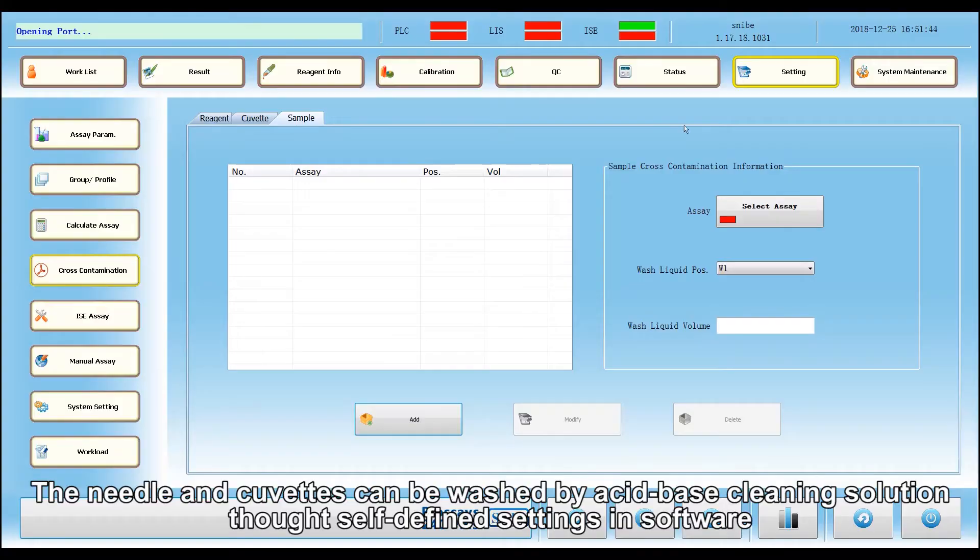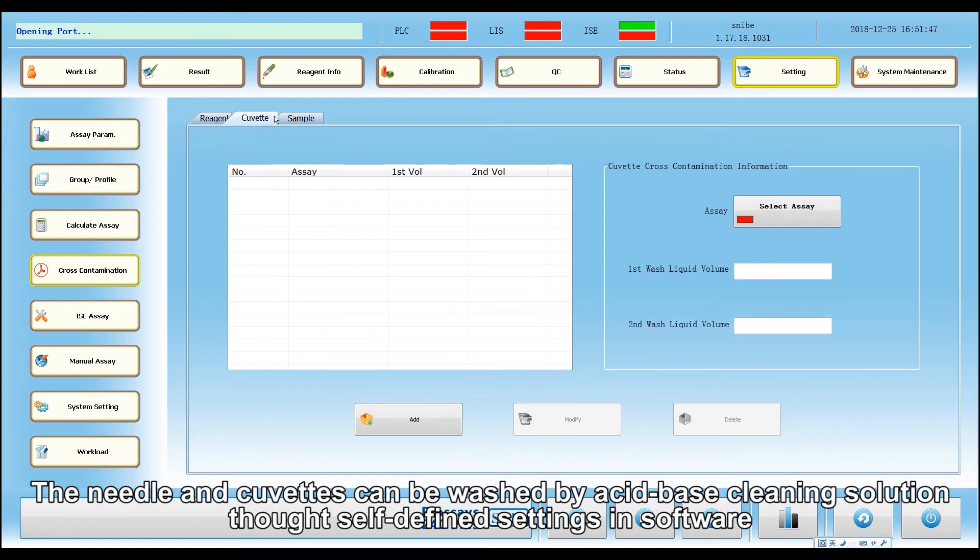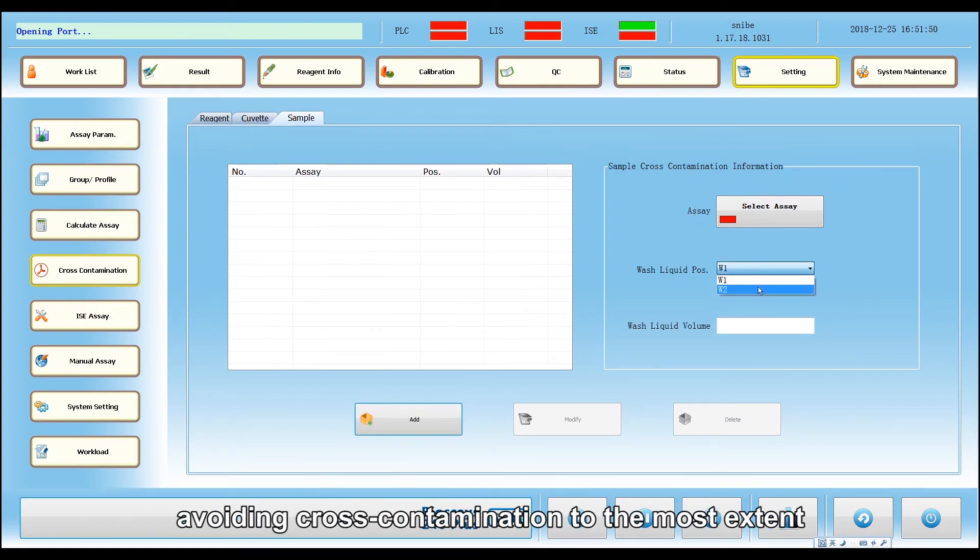The needle and cuvettes can be washed by acid-based cleaning solution through self-defined settings in software, avoiding cross-contamination to the most extent.